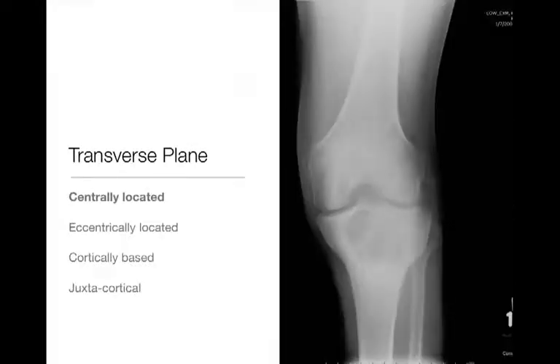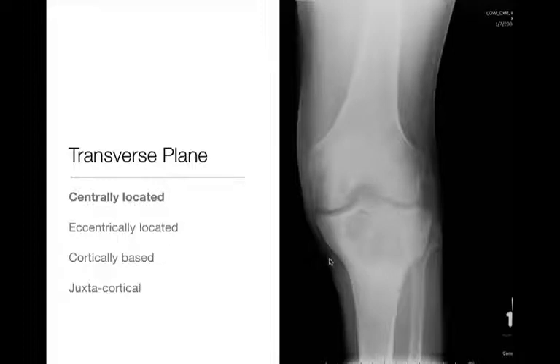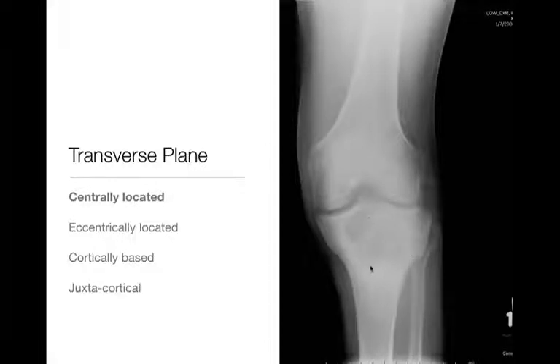In the transverse plane, we describe whether the lesion is centrally located — as in this case where we see a lesion centered in the proximal tibia — whether it's eccentrically located, cortically based, or juxtacortical. Here we have a geographic lytic lesion with a narrow zone of transition and a non-sclerotic border, centered in the proximal tibia in the metaphysis and extending into the epiphysis. This is an example of a centrally located lesion.